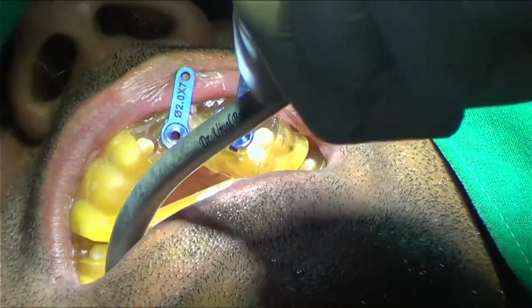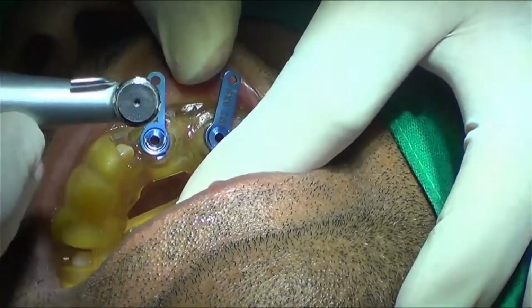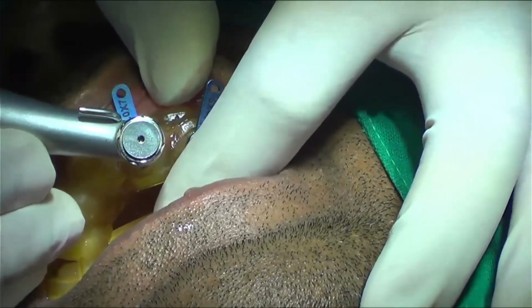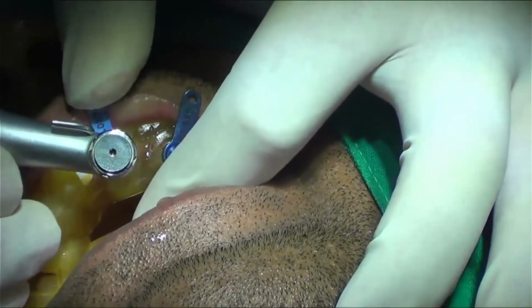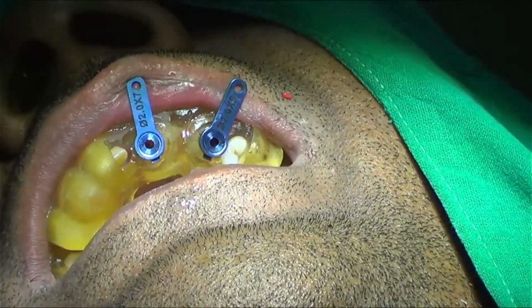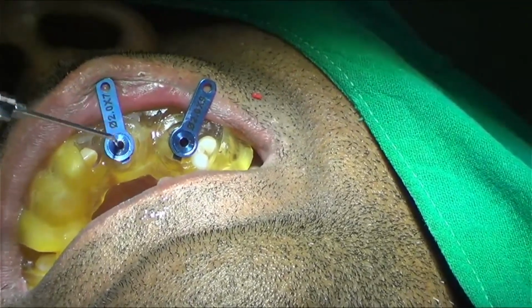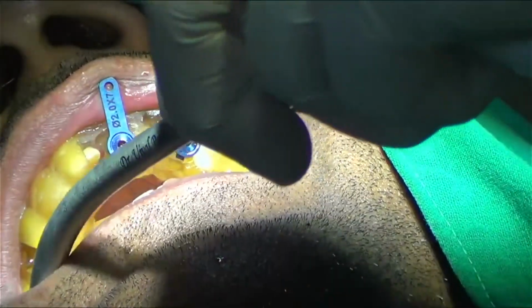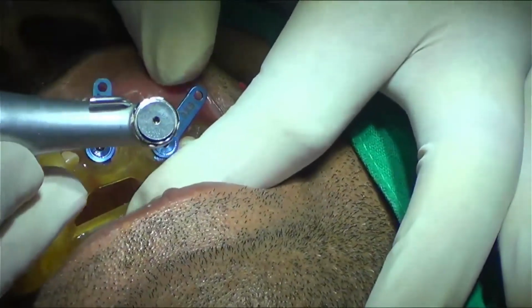Now next I am using the 2 into 5 mm drill. Again I am holding the guide and I am still at 300 RPM. I am placing the drill, and with my irrigation open, just see how I am stabilizing the drill.